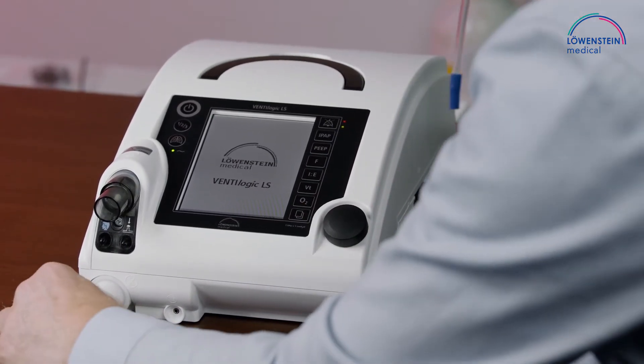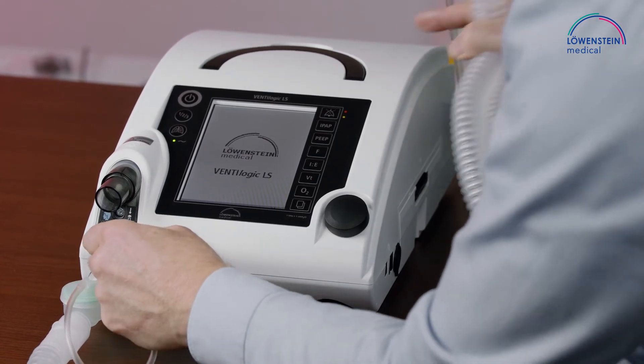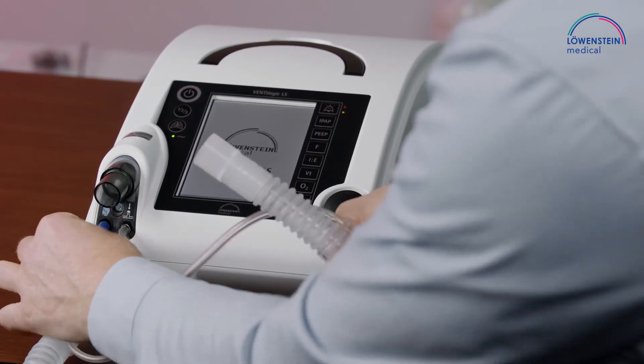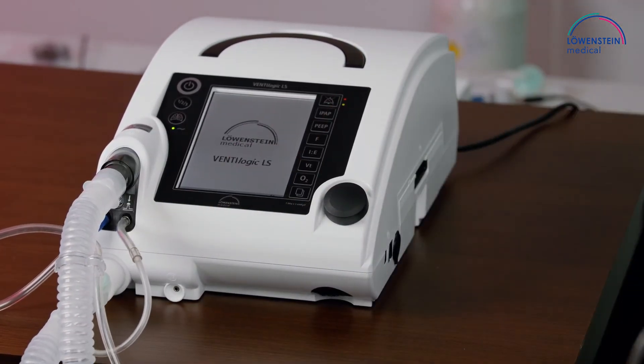Stick the valve onto the module, connect the valve steering on the right, and the pressure measurement line on the left to complete your ventilation circuit.